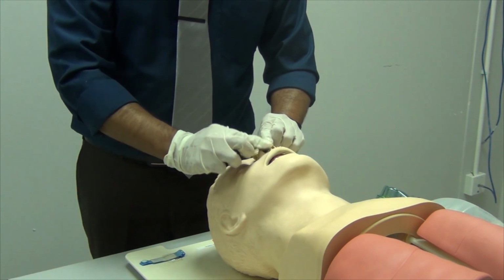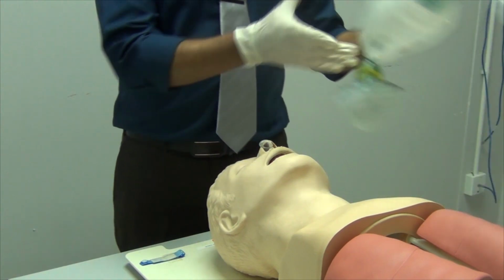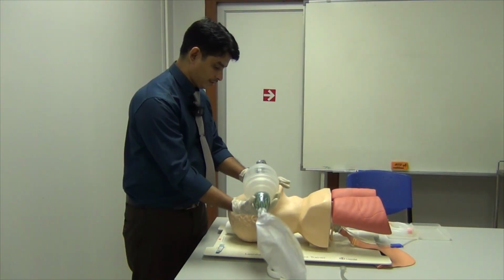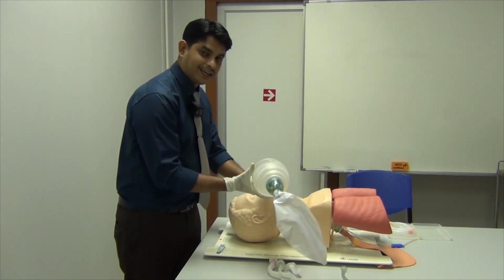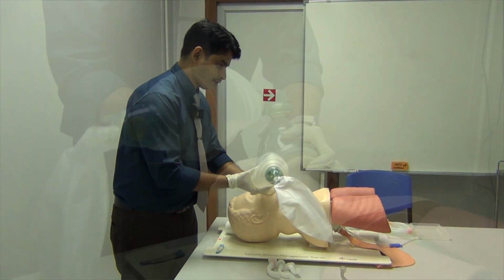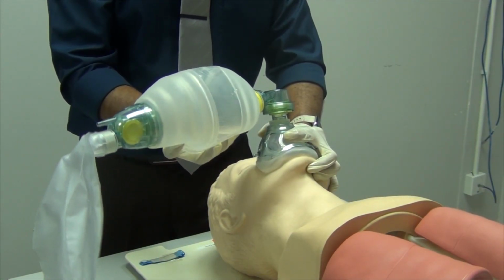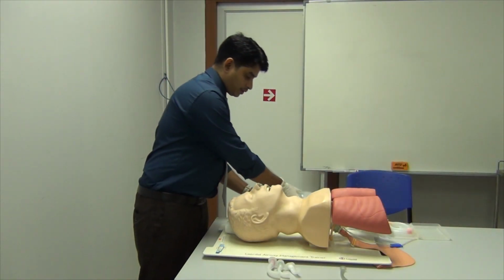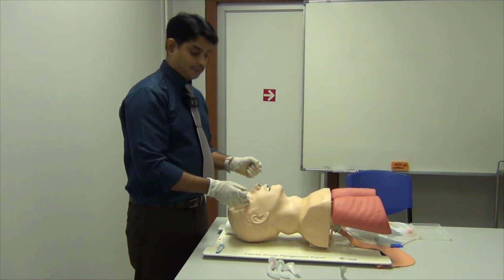When properly introduced, the flange sits on the nostrils, then you can go for the oxygen delivery, right? Choose an appropriate size mask, use the CE technique, then give oxygen. I am giving it through an ambu bag. You can connect the face mask with oxygen to maintain the oxygen supply.